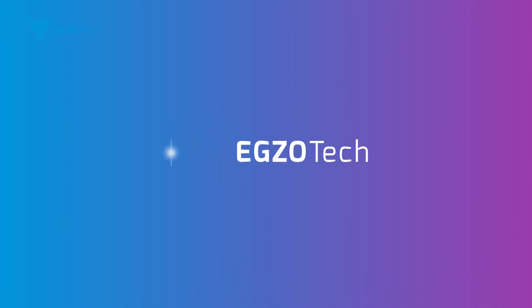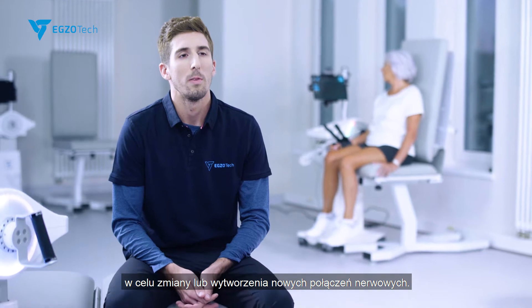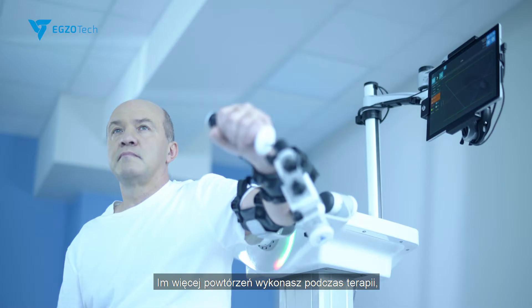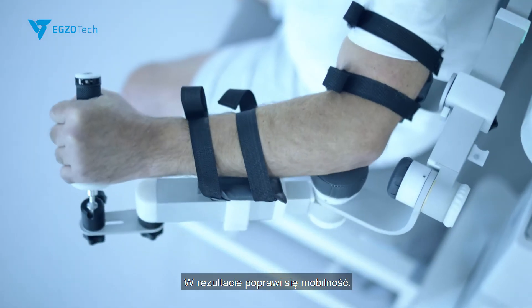Neurons that fire together, wire together. The brain uses its neuroplasticity mechanism to rewire itself and form new neural connections. The more repetitions you perform during physiotherapy, the more your brain rewires itself. As a result, mobility improves.